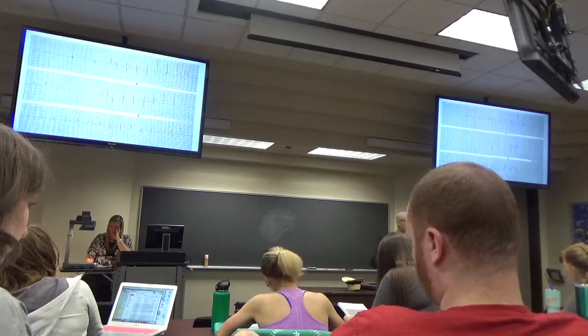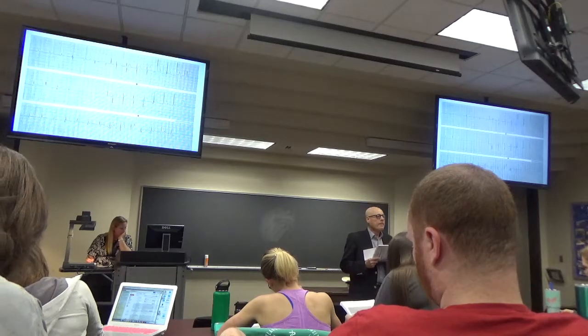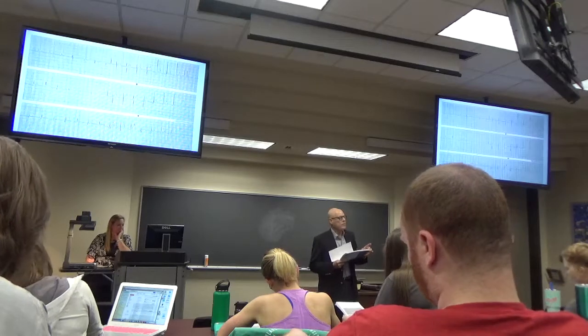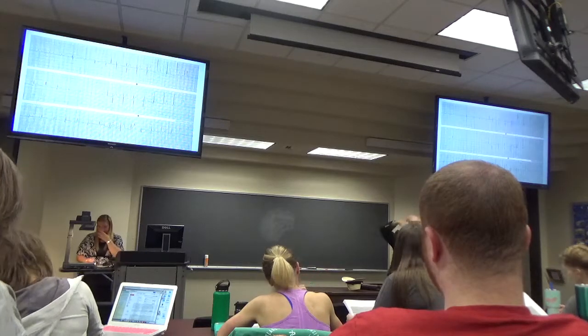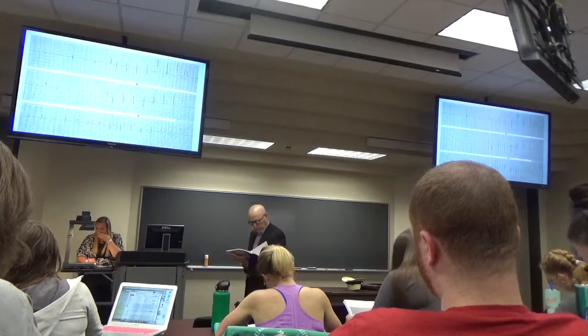Any disagreements with this? I probably would not call the anteroseptal injury. You're calling that because the ST segment is above the baseline. But the ST segment's very concave, T waves upright. I probably wouldn't call that on this one.